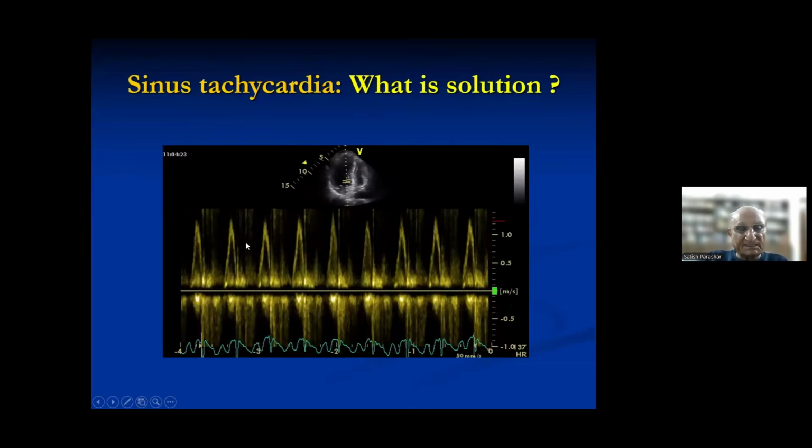Now see, this is tachycardia. We don't know which is the deceleration slope. We don't know which is the A wave. We don't know anything, so we cannot find out anything except the peak velocity. We cannot find out the peak and mean gradient. That is why we always prefer doing an echo at a lower heart rate, below 100, preferably near about 90. The lower the heart rate, the better will be the slope.